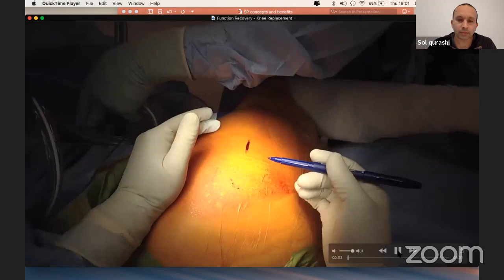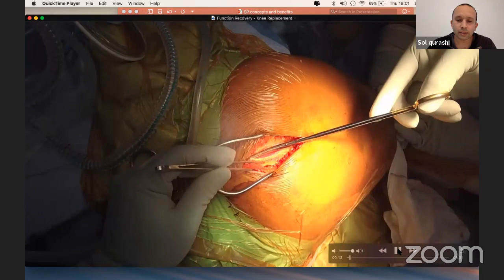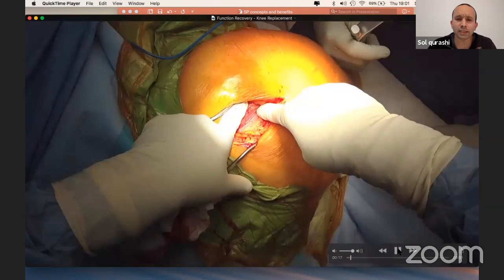There's my skin incision. Probably a little bit bigger than usual. There's the glute max fascia. There's gluteus maximus being split by fingers. Then they lift the knee, take the tension off it. Then I enter, they see that, let me show you that.